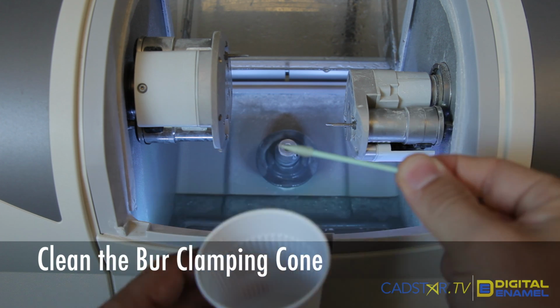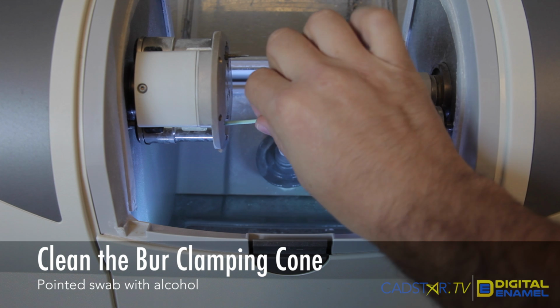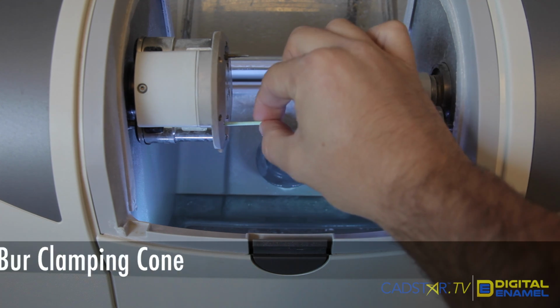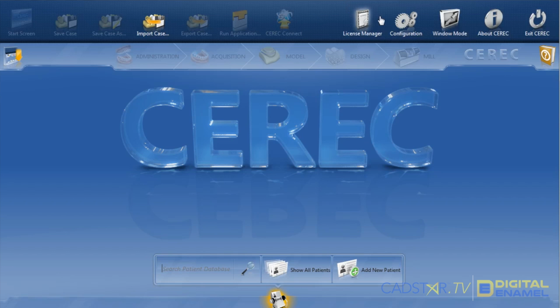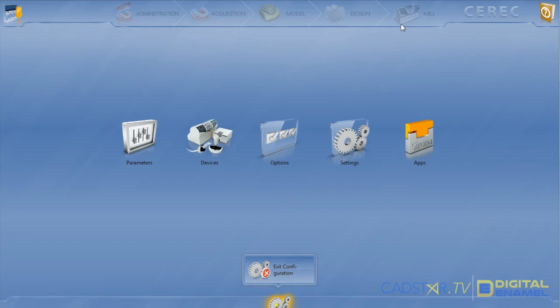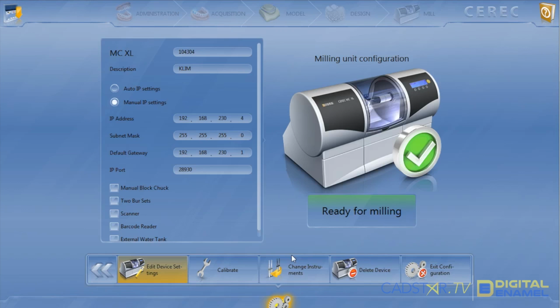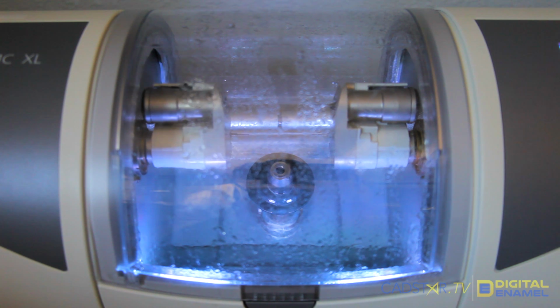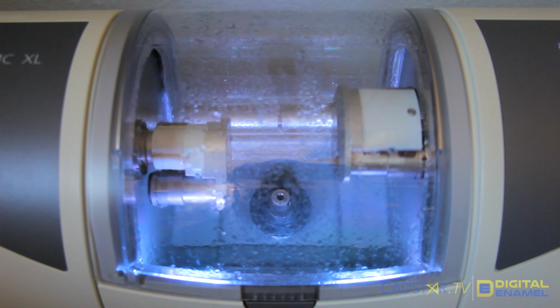The first thing we're going to do is clean the clamping cone for the burr sets. So you just need isopropyl alcohol and the pointed tip. In your CEREC program, you just want to go to the configuration at the top of the screen, go to your devices, click the milling unit you want to change the burr on, and we'll hit the change instruments button at the bottom. And this will get the motor set up so that you can take out the burrs.